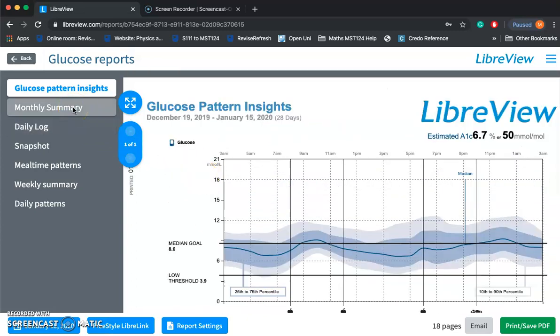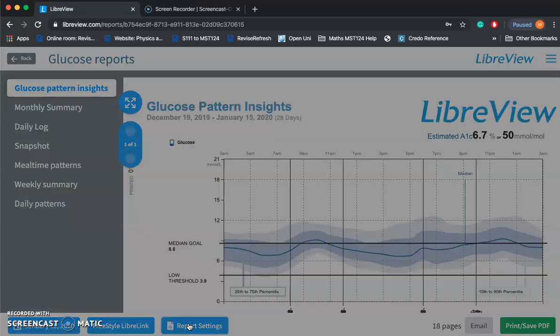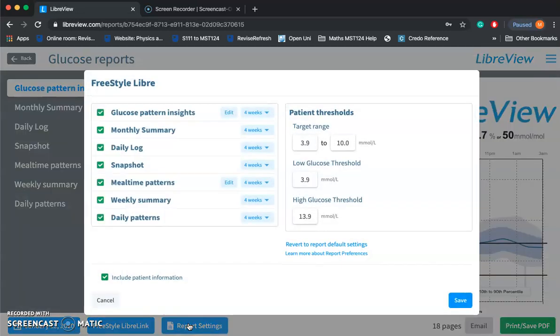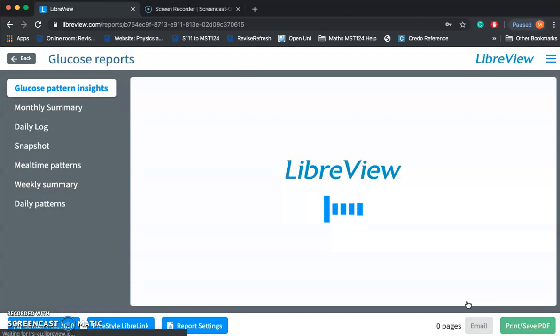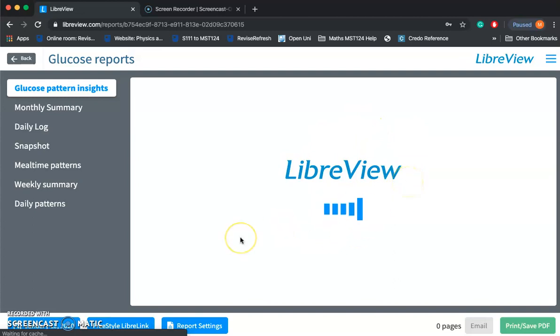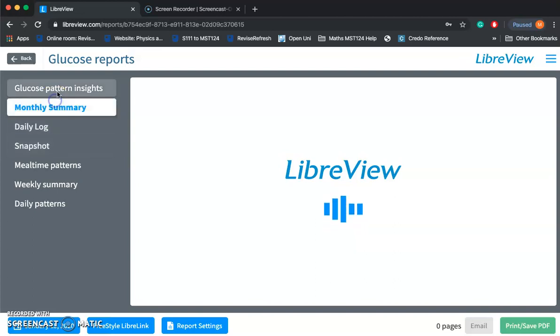On the left-hand side there's also a monthly view. Going to Report Settings at the bottom, you can change your target range, your low glucose threshold, and your high glucose threshold. You can also change each menu item to show 90 days, 60 days, and so on. I'm going to change the first one — Glucose Pattern Insights — to 90 days and press save, and that will display the graph as a 90-day chart instead of the default month chart.